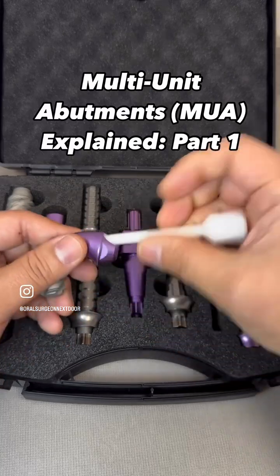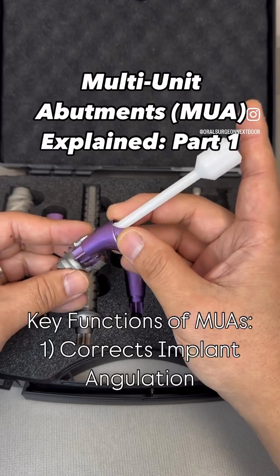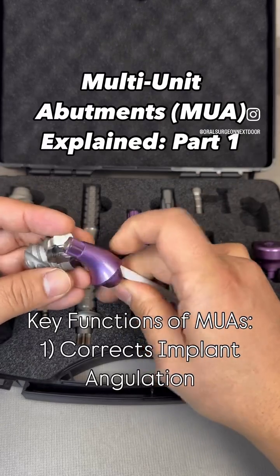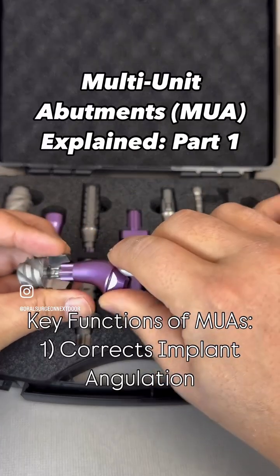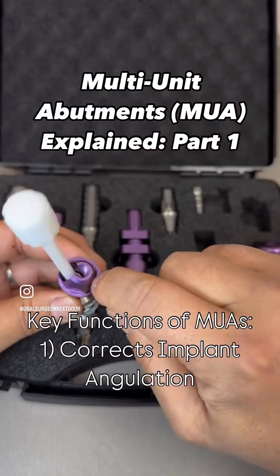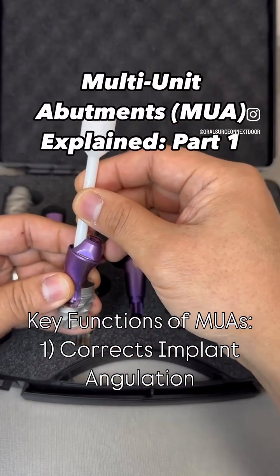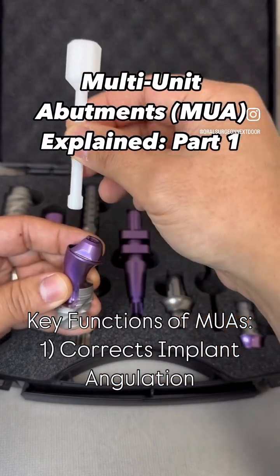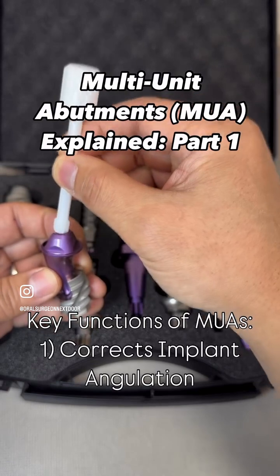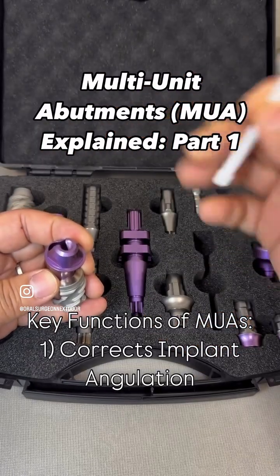In that case, if there's enough restorative space, you could use this angle correction — that's the biggest advantage of having a multi-unit abutment. Basically, you put this screw in there; there's a little screw that goes in and sits to the implant, and once you secure that, you have an angle-corrected platform. In this case, this is a 17-degree Straumann SRA, and instead of having to come out parallel to the implant axis, you can do angle correction to make sure the screw access angulation communicates with the rest of the full-arch implant.